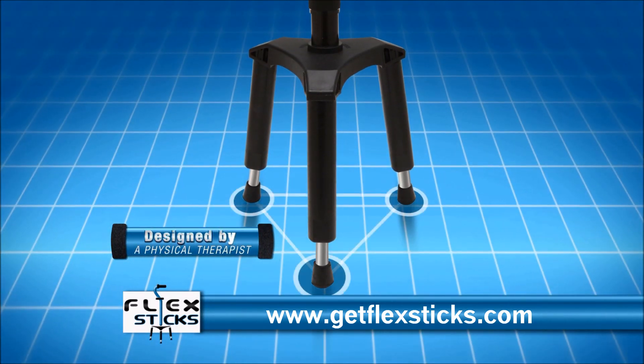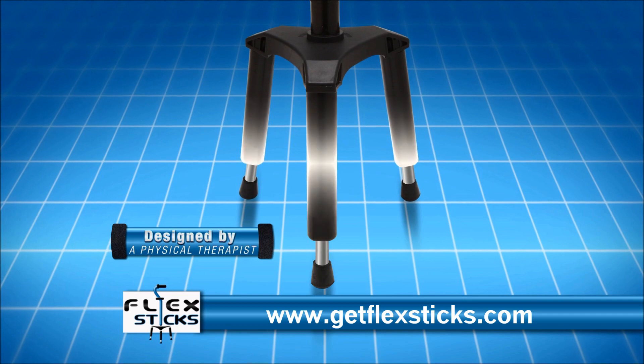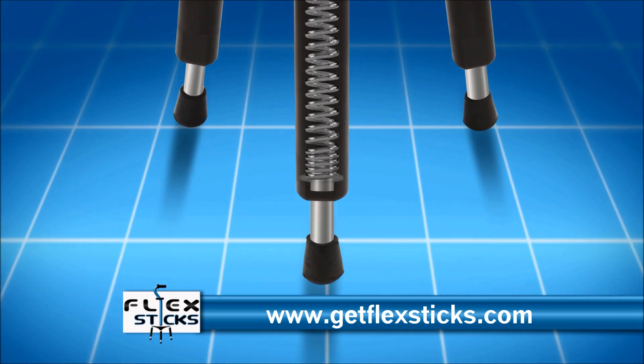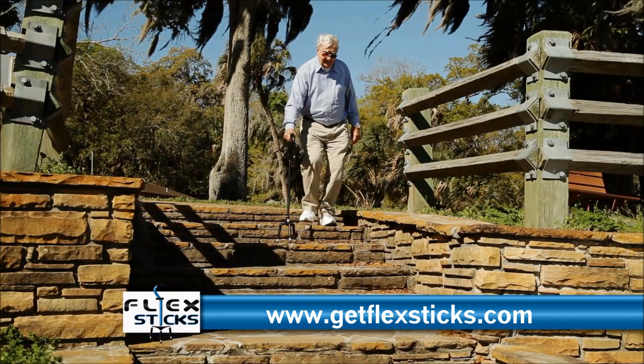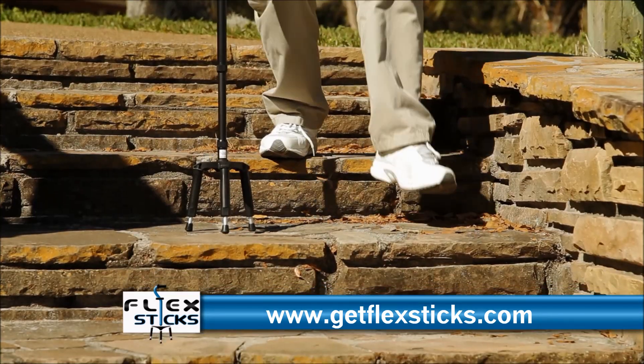The secret is FlexStick's constant point-of-contact patented design. With three flexible, shock-absorbing legs, you maintain three points of contact at all times with the ground, giving you the freedom that you want and the comfort you deserve.